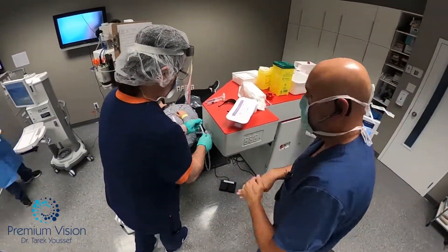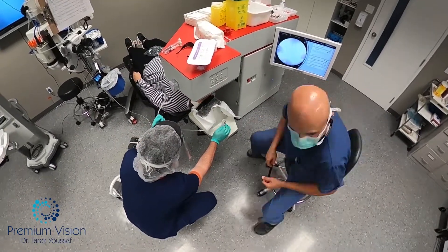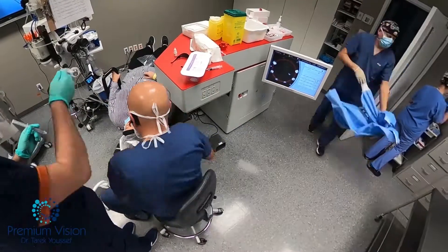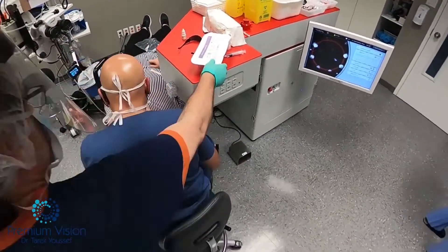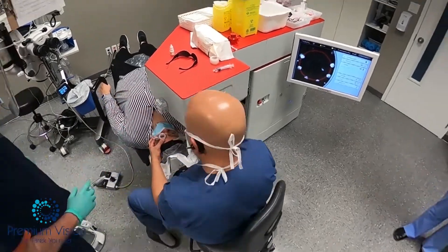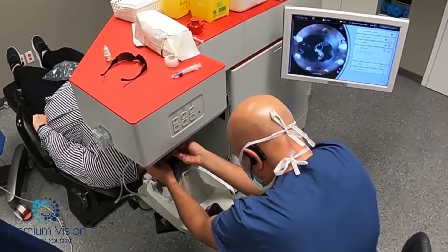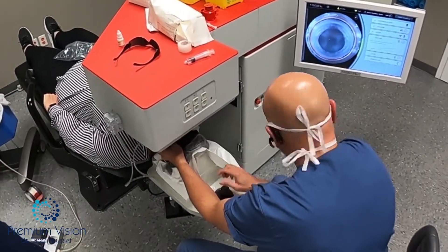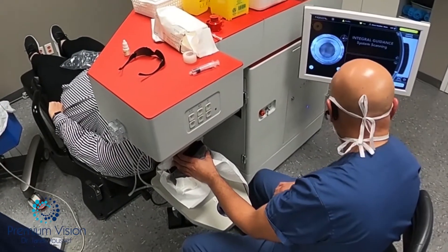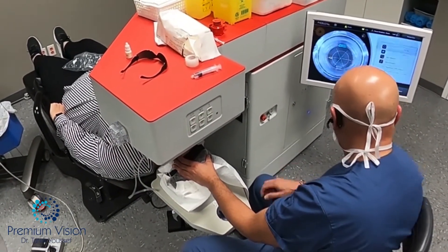The bed will go down for the laser. Inserting the tubing again. Review the plan. Move the patient under the laser. Wet the lens so that air bubbles don't stick to the laser lens. Position the air bubble, wipe the air bubble. Capture, scanning with OCT — the front and back of the cornea and the lens, limbus and the pupil.